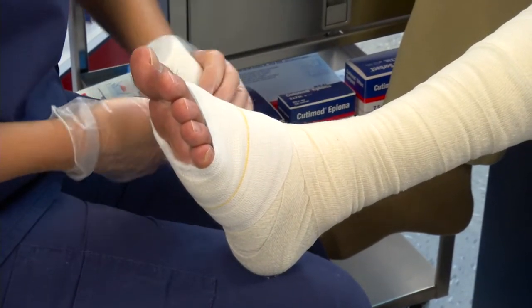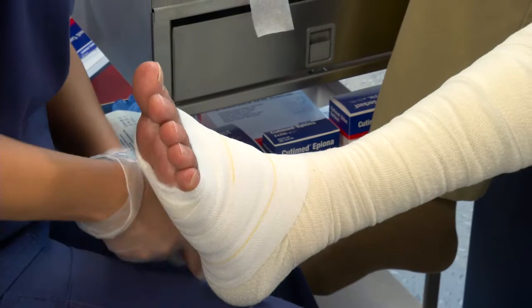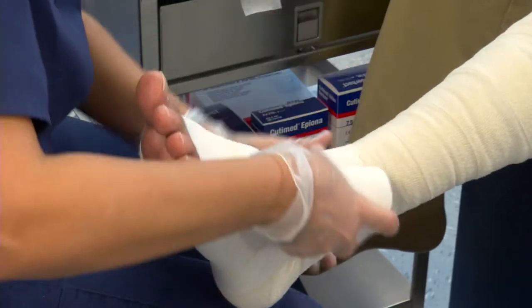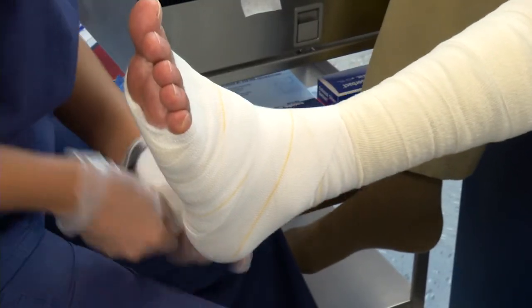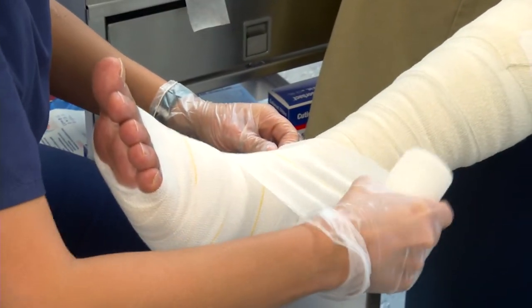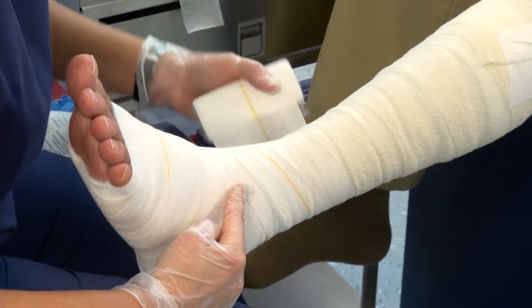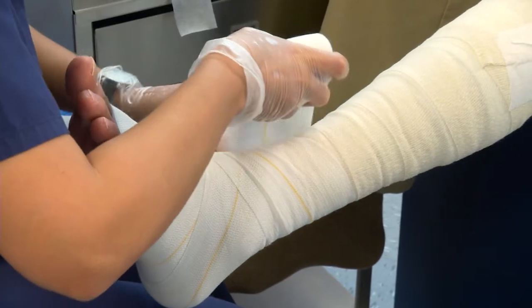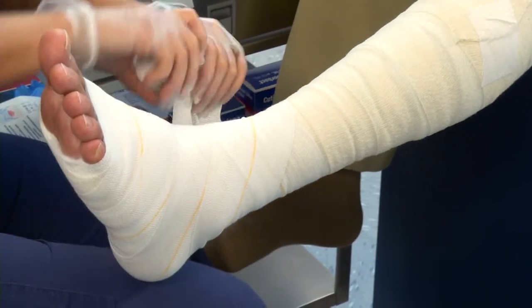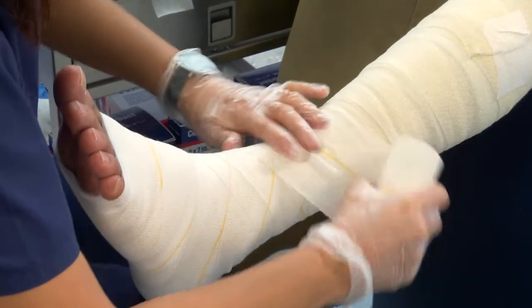We're going to start at the base of the toes and anchor twice around. When we get to the ankle, we're going to do a figure of eight and come back and capture the heel. Now we're going to start our figure of eight pattern up the leg. You can use your yellow line as your guide. We're going to come up and come back down using the bottom yellow line to guide our bandage. You want the edge of your bandage in alignment with that yellow line. When we come up on this side, we're going to use that bottom yellow line as our guide.